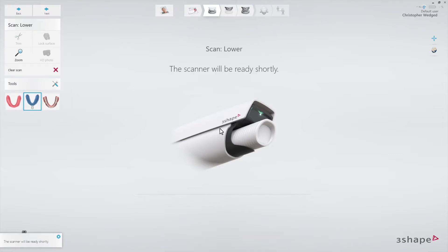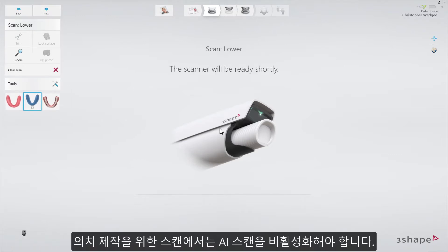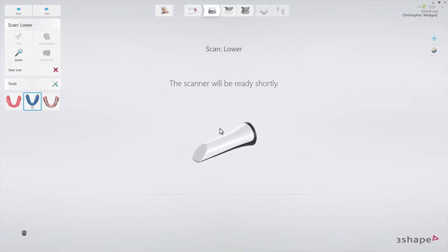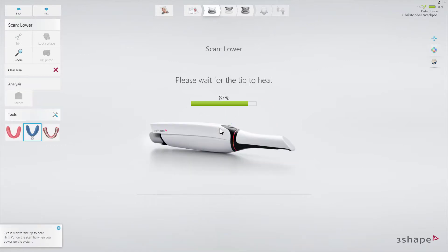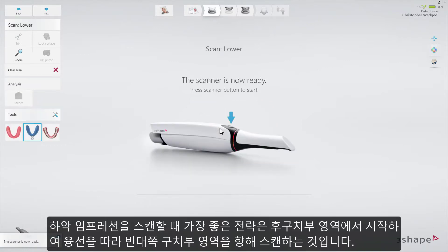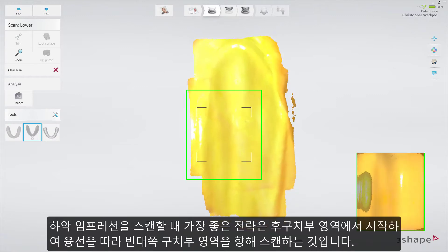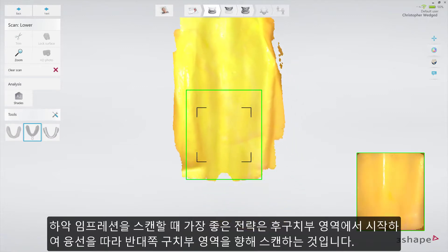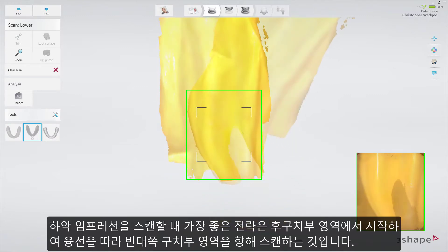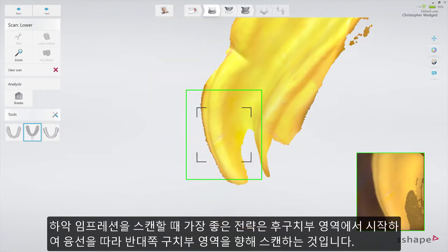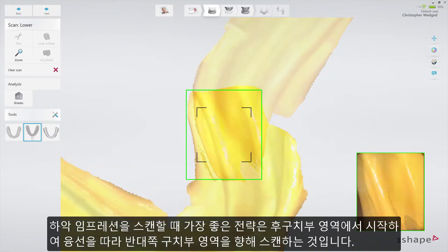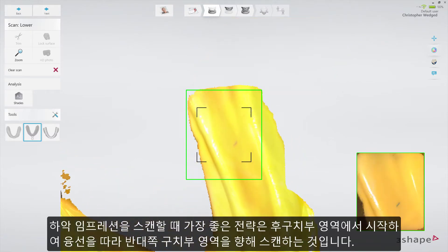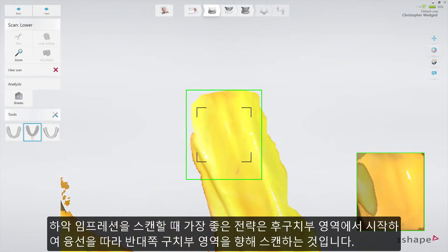Start the scanner. AI Scan should be disabled for this type of scanning. The best scanning strategy for a lower jaw impression is to start at the retromolar area on one side and scan along the ridge towards the retromolar area on the other side.